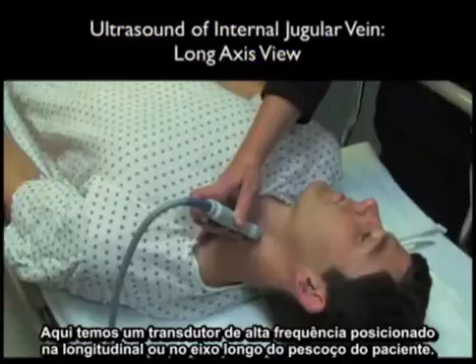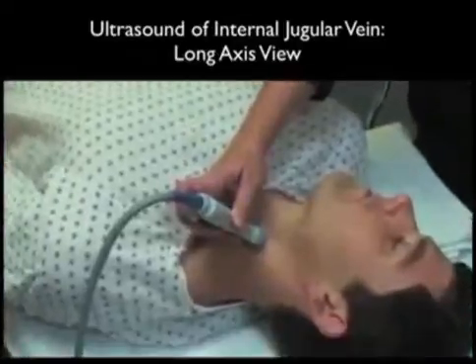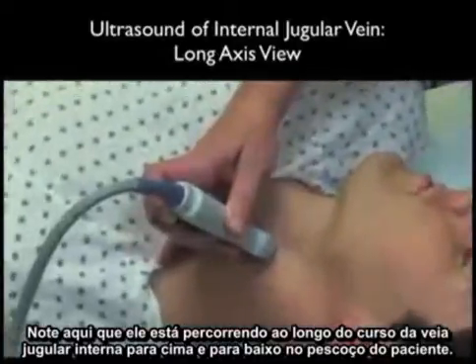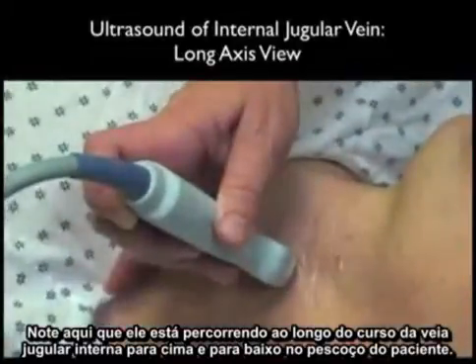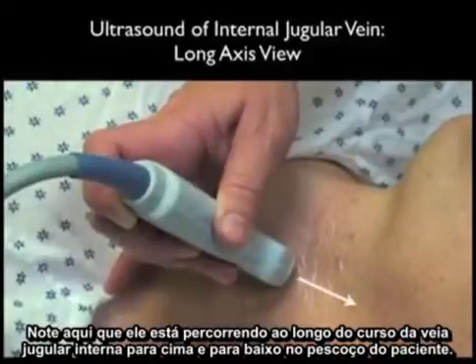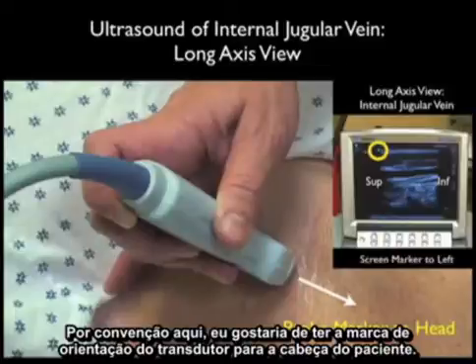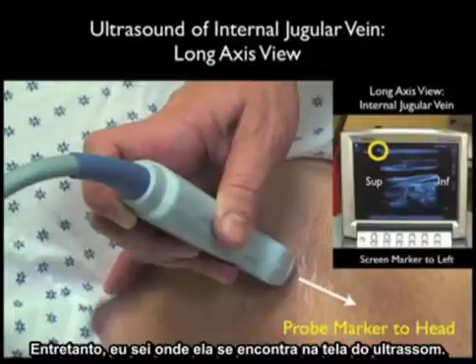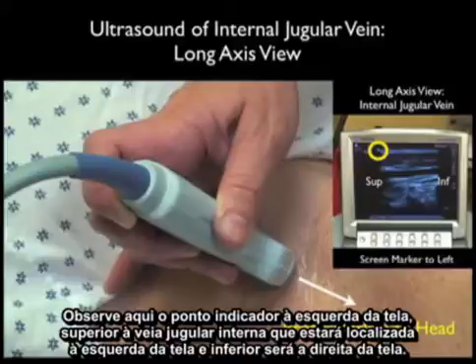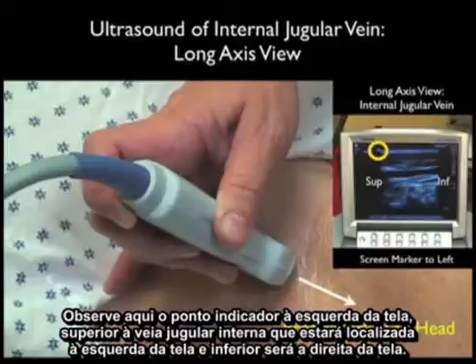Here's the high-frequency probe placed in a longitudinal or long axis manner on the patient's neck, running along the course of the internal jugular vein as it runs up and down the neck. By convention, I like to have the probe marker towards the patient's head so I know where it lines up on the ultrasound screen. With the screen indicator dot towards the left, superior on the internal jugular vein will be located towards the left of the screen and inferior towards the right.